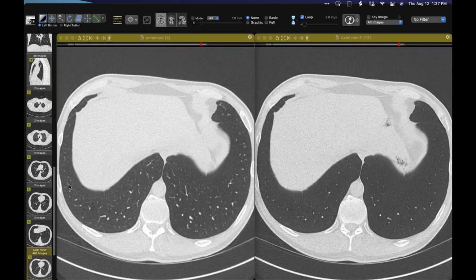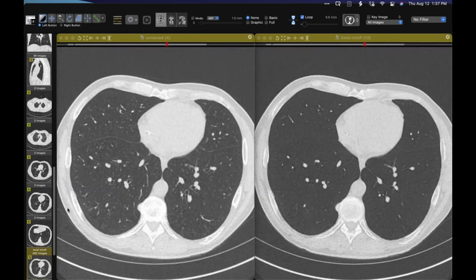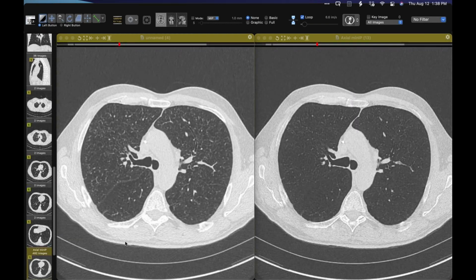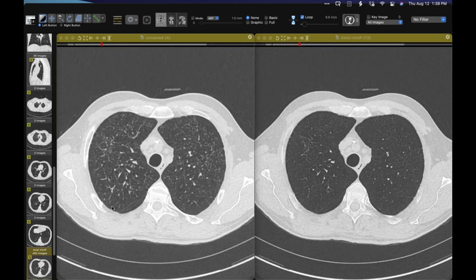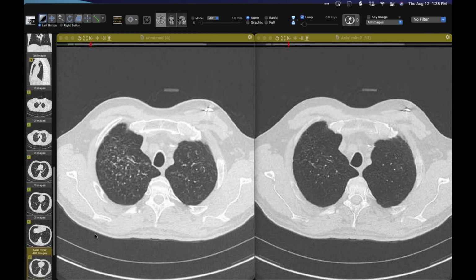Down here looks all right. And we begin to get some rather unusual subpleural cystic spaces round about here, which are relatively large, and then there. Then, of course, we get these reticular opacities, and then it's more profuse in the upper lungs. Definitely involves the central lung regions and the peripheral lungs as well. And I'm trying to bring out the fact that in areas like this, I believe there are some additional cystic changes and some architectural distortion of lung.